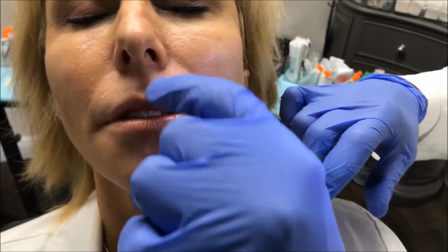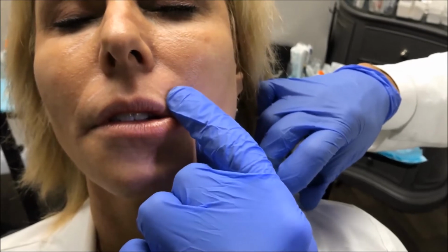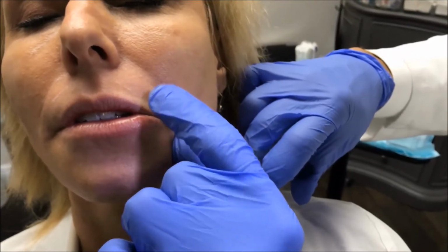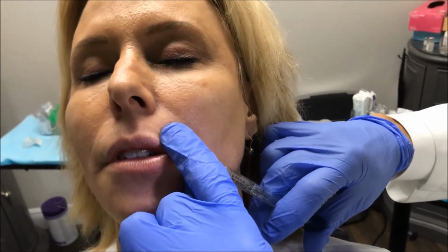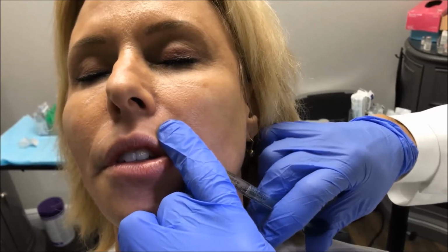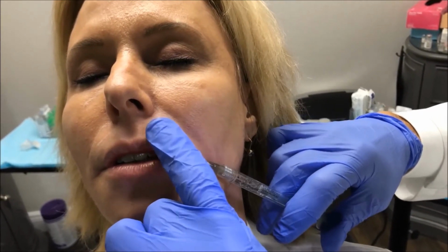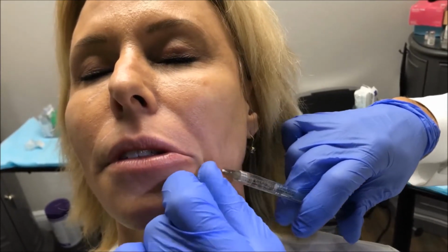Okay, now I'm going to come back. So I've done that. I filled this region. Now I'm going to come back and do that same submucosal shading technique for the upper lip. Okay, right here I'm in the vermilion border. Kind of see the tip of the micro cannula right there. And I'm just putting tiny little micro aliquots of filler in. Good.